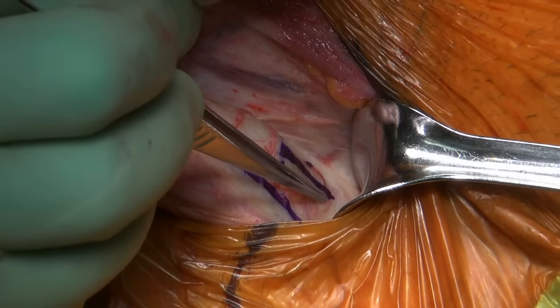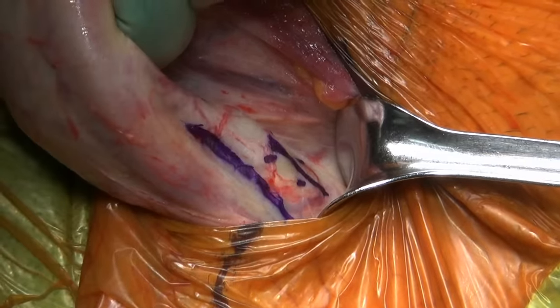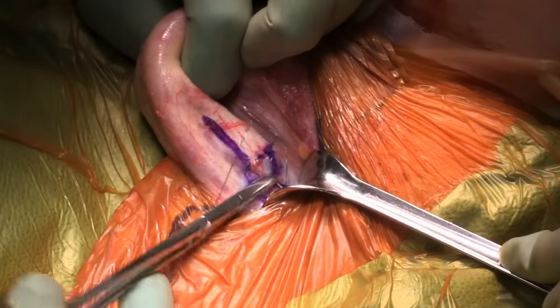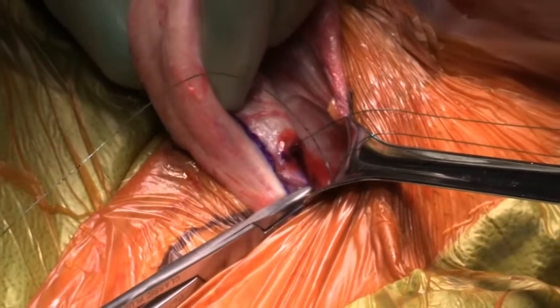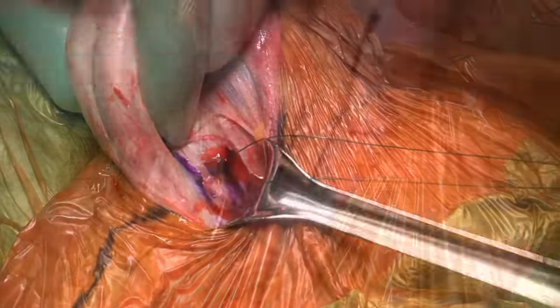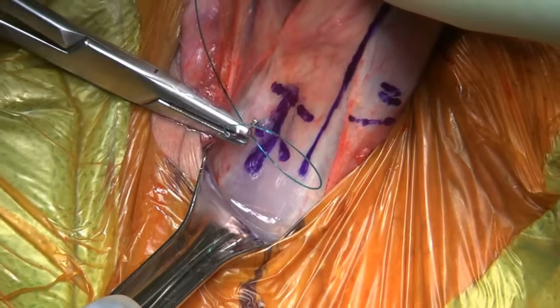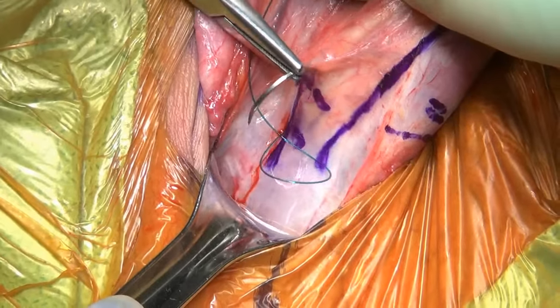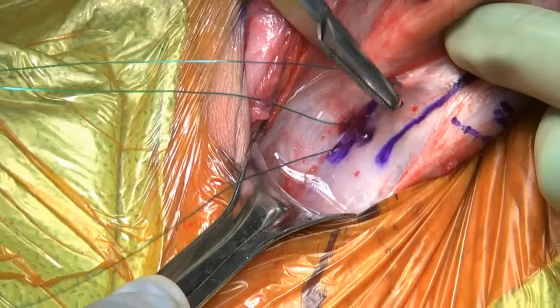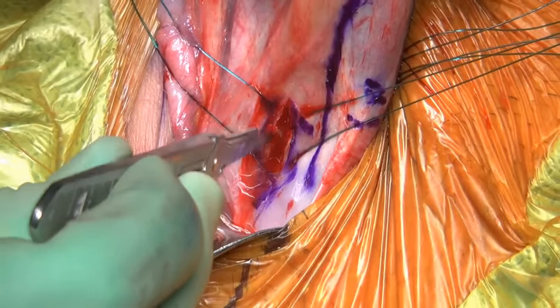I will extend my incision below where my stitches are to allow for tubing egress, and I estimate that our incision is 1.5 cm in total length which will allow us to easily implant the device. Next we place our stay sutures. These are full thickness bites that are placed evenly. I try to match those paired holding stitches so that they line up on either side. Now I do the identical steps on the other side. We now incise the corpora cavernosa and I prefer to do this sharply with gentle brush strokes to avoid over dissection.